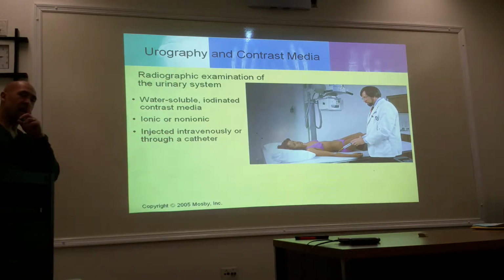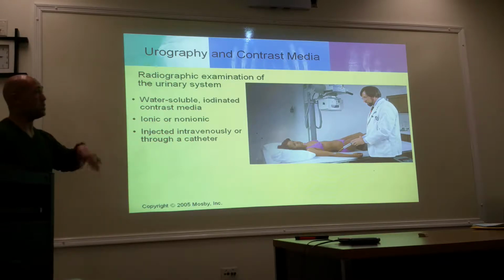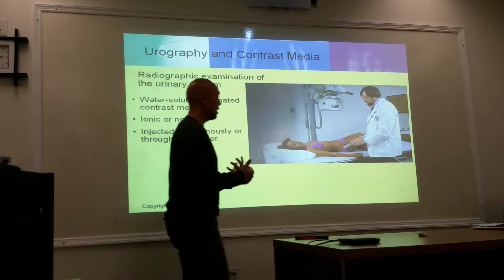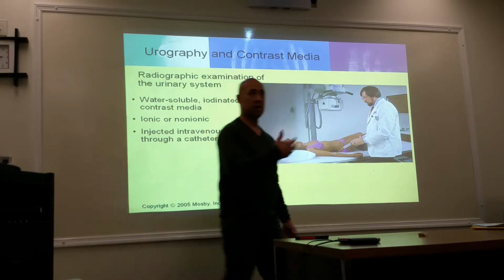Have you guys seen an IVU or an IVP in your department yet? I saw a VCUG. A VCUG, okay, but that's going through the bladder. Has anybody seen an intravenous type of procedure with injected contrast? You'll be seeing a lot of this in CT, and hospitals are getting back now into doing these procedures in the radiology department. What happened for a long time was that we did these studies and then it went away and went to CT because CT was a little bit more diagnostic.